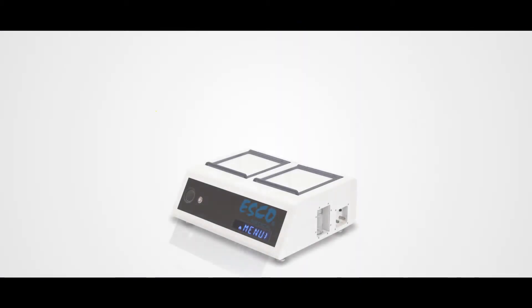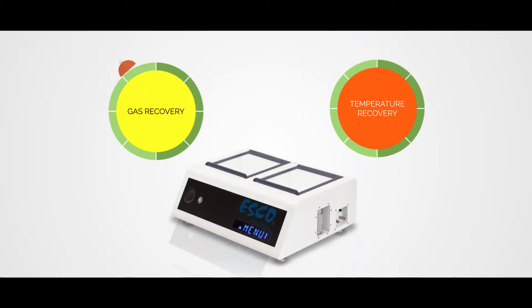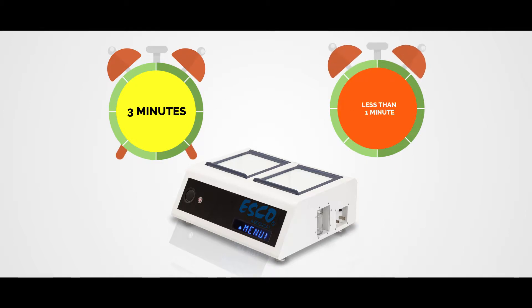This compact design also allows for excellent recovery rates: 3 minutes for gas recovery, and just within a minute for temperature.